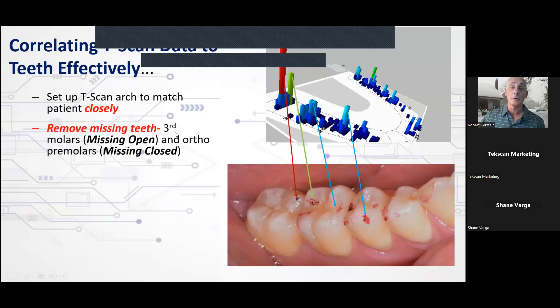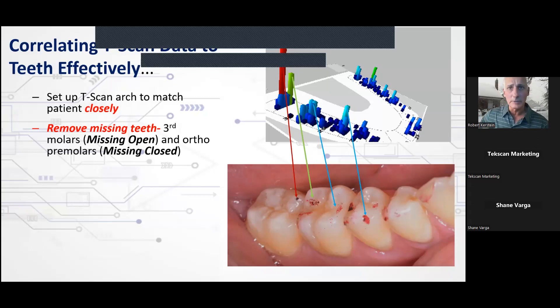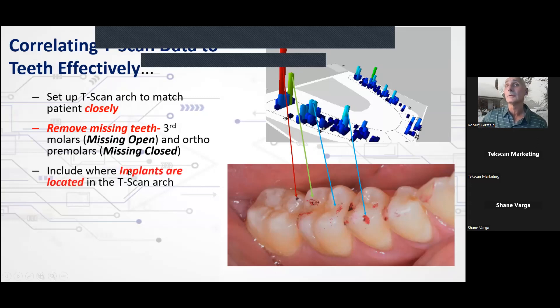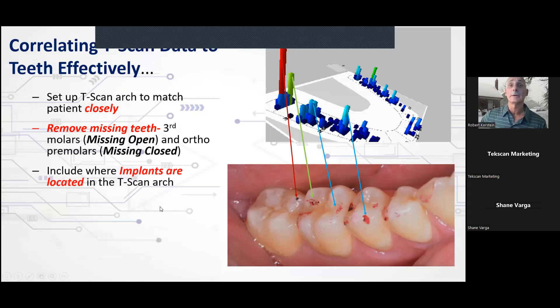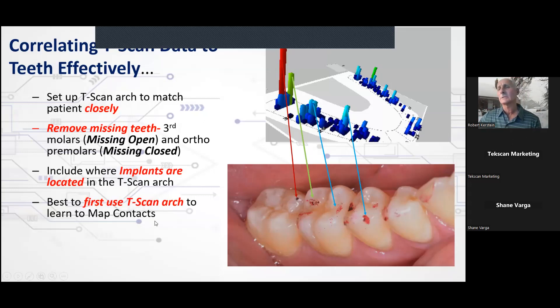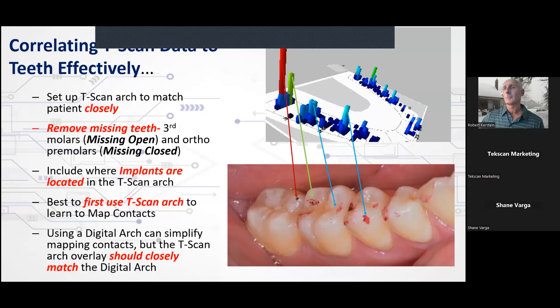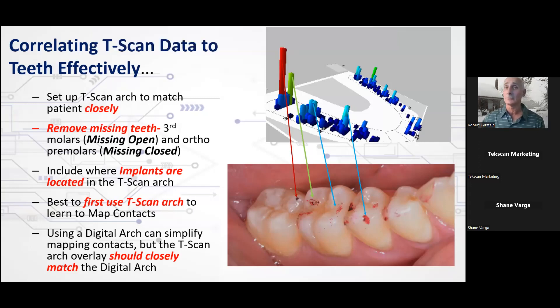It's essential that you remove missing teeth. Third molars come under 'missing open' if totally missing. Removing orthodontic premolars or any tooth moved to close the arch — choose 'missing closed.' Include where implants are located in your TSCAN arch, because you will not activate the implant warning unless the implants are denoted. Also, I'd say to first learn to use the TSCAN arch to map your contacts to the articulating paper marks, then transfer that information to the digital arch.